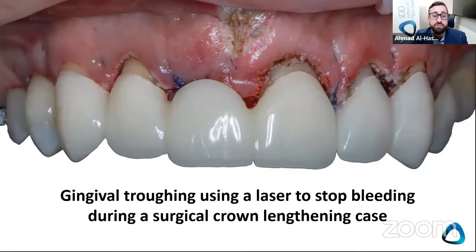Here's an example of gingival troughing with a laser. This is a surgical crown lengthening case that I did. Again, gingival troughing can be useful with a laser if you're getting a lot of blood and you need a bit of hemostasis as well. If there's a lot of blood and you can't control it with hemostatic agents, a laser can be very useful because you can both move the gum out of the way and stop bleeding.